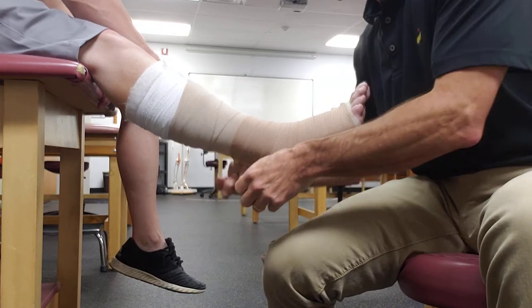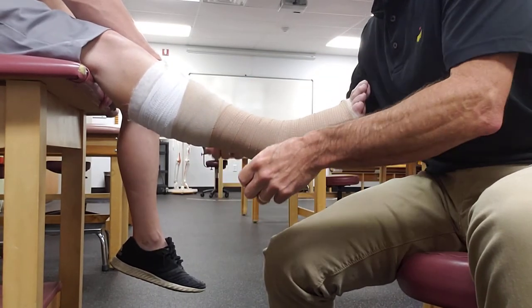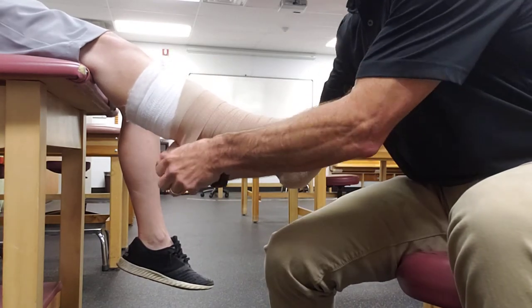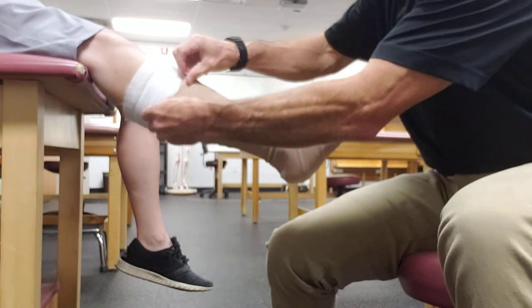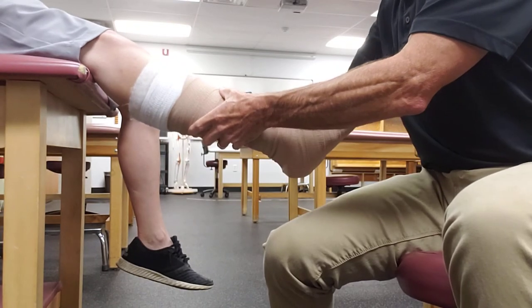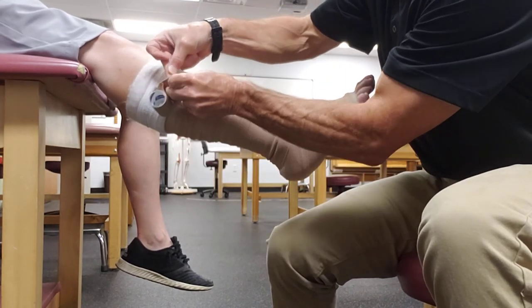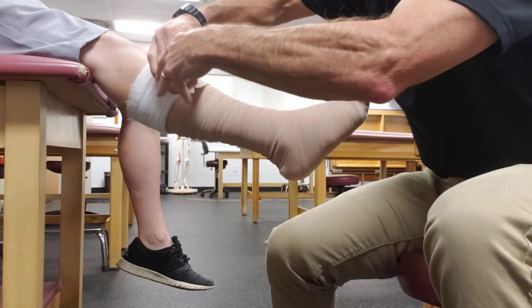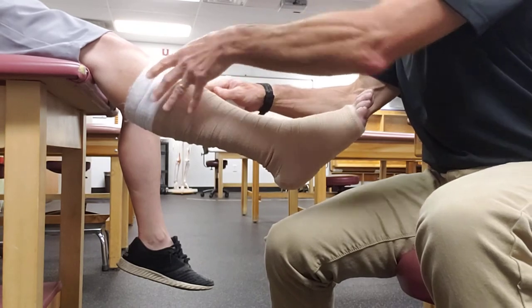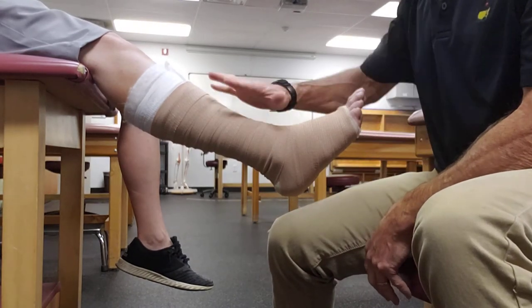When you put this dressing on, the person can walk around in it. We encourage activity for venous wounds — they want to minimize how much they let the leg hang down, but it's okay to be up and walking. The hard part is putting a shoe on, because all these layers and padding make the foot and leg really bulky. A lot of these patients are used to having a lot of edema, so they've figured out what they can wear — usually slides or house slippers with a lot of give. All this stuff comes in a package together when you buy it as a multi-layer kit.